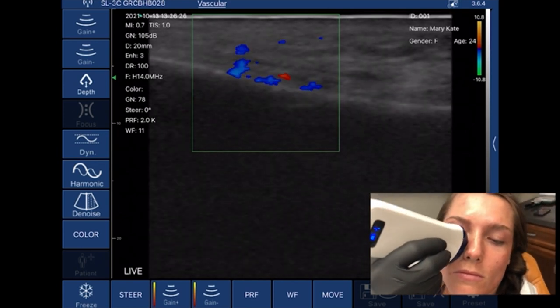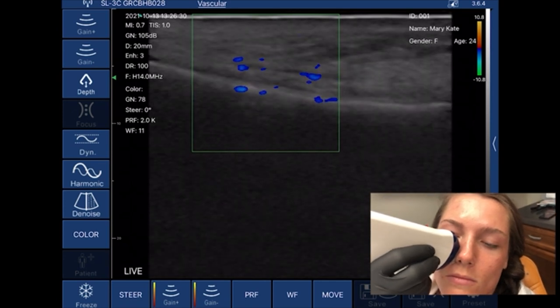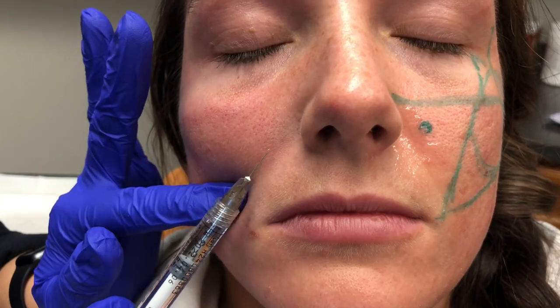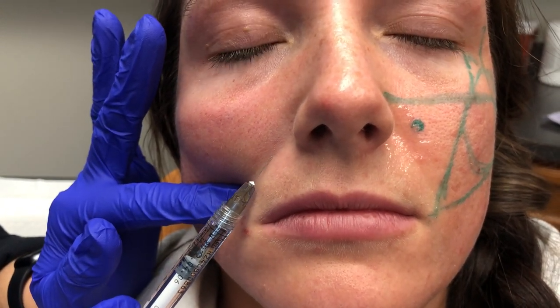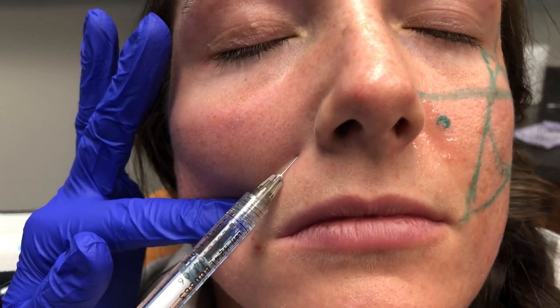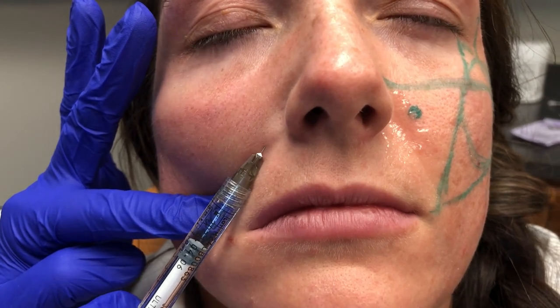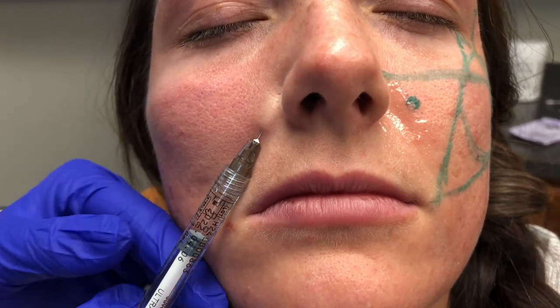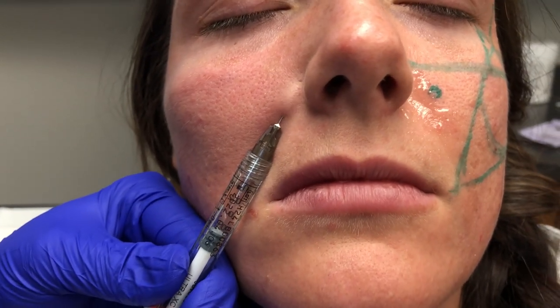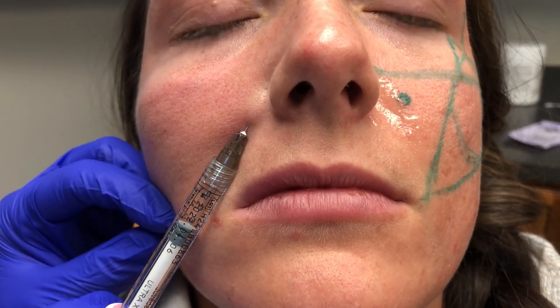The WAVE-FE is the ultrasound — it's certainly the new wave in facial aesthetics. The patient is having some cheeks done as well, but on this side where I was going to do a deep piriform fossa injection, because of the ultrasound imaging that told me exactly where the facial artery is, it's now a mid-dermal injection to go ahead and fill this up. Still using the AFI safe injection perfection protocol: aspiration, low and slow, never give much retrograde injection all at one time, watch the tissue — all of that is still the same.